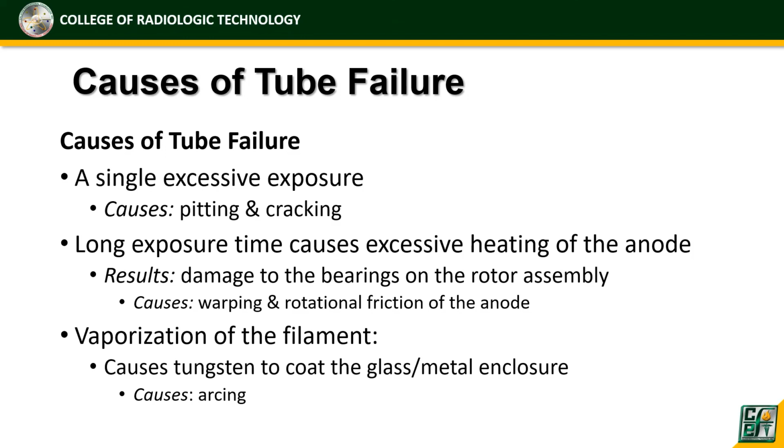So ano yung maaaring makatulong to extend the tube life ng X-ray tube? Kailangan proper warm up ng X-ray tube. Before using the X-ray tube for the day, kailangan i-warm up into different kV and mA. Siyempre, kung matagal na hindi nagamit, i-warm up din natin ang ating X-ray machine. Then, of course, avoid single excessive exposure. Avoid long exposure time.